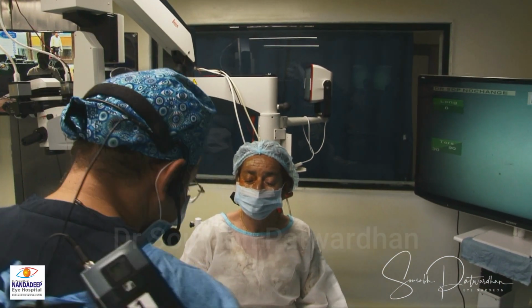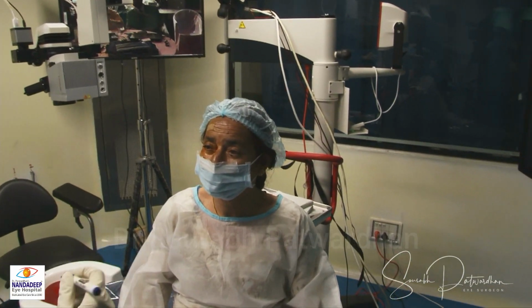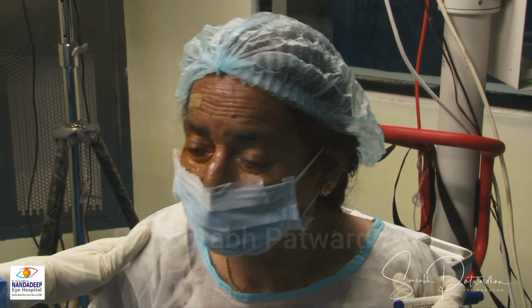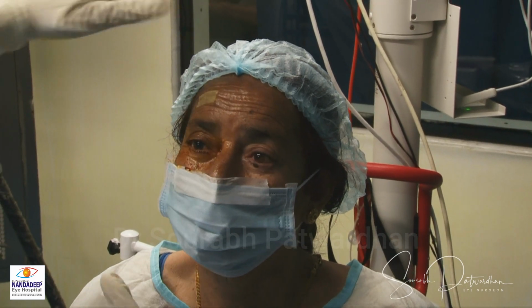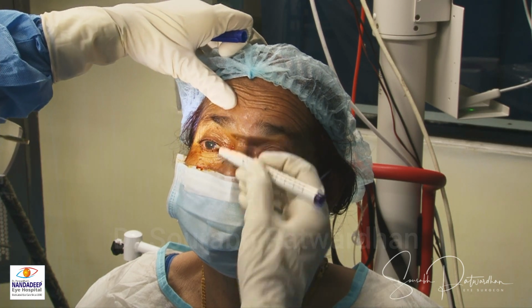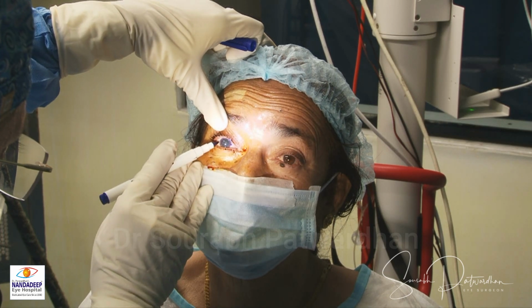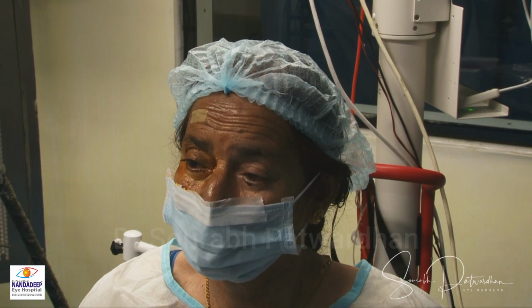Yes, sir. Okay, so I'm just going to ask the patient to look straight ahead and then mark free hand with the marker pen. Look straight at me, keep the eye wide open. Okay, so this is the first mark which goes in. And second mark. So it's a free hand mark.